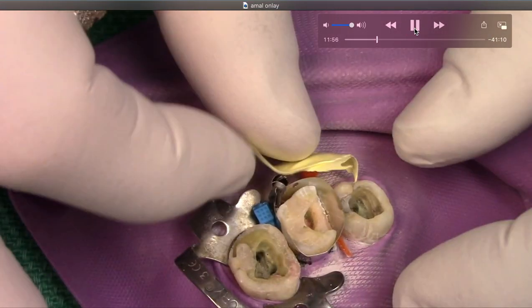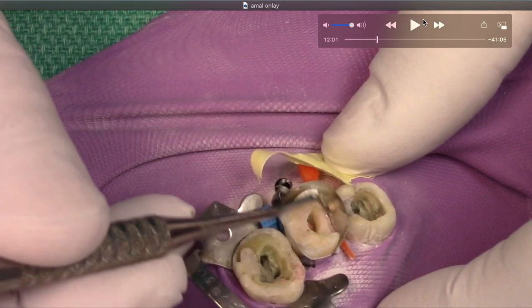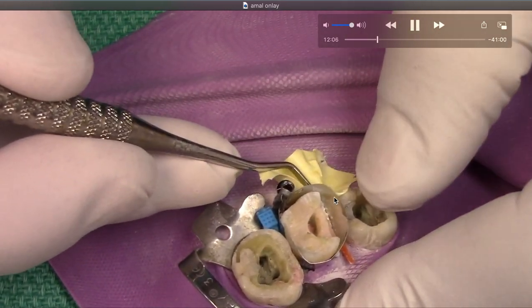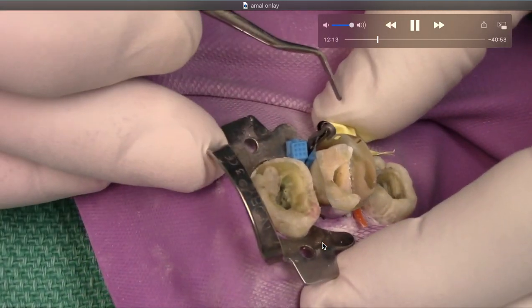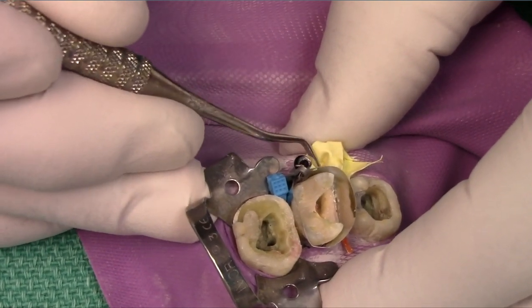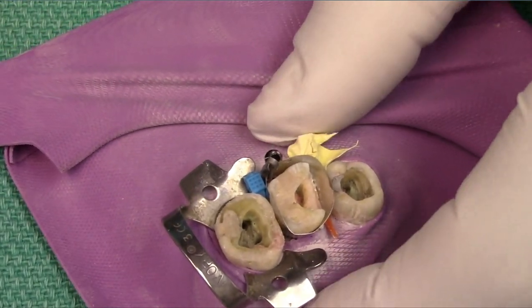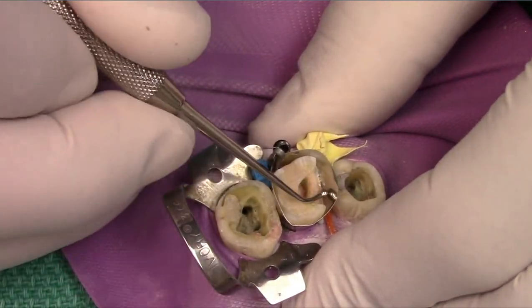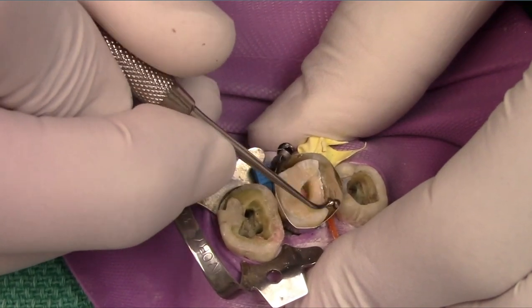One of the other things I wanted to mention: if you haven't used plumber's tape or Teflon tape — this is actually really thick, there's usually a thinner type — you can pack it in to get that contour. Literally watch me pack it in, and that seals the floor. When creating these restorations, the most important part in my mind is the gingival health of the tissue. Too often we're focused on the easy things. The real critical one is to make sure you don't get any overhangs.